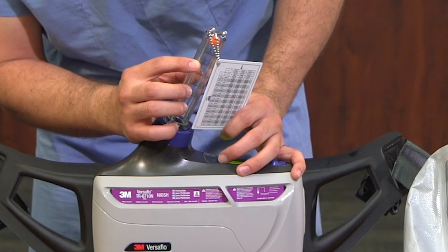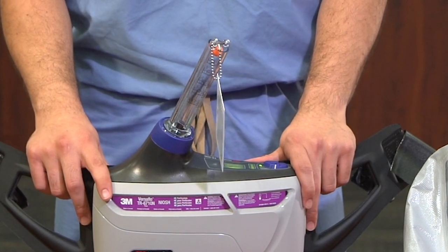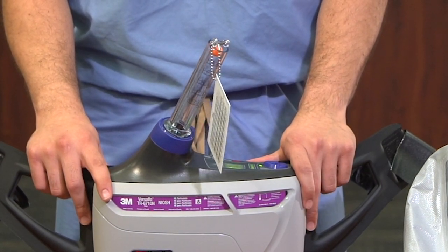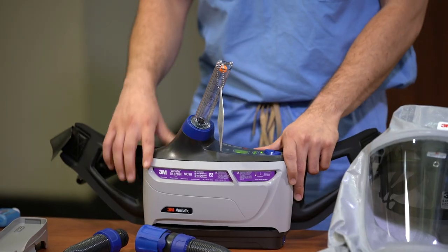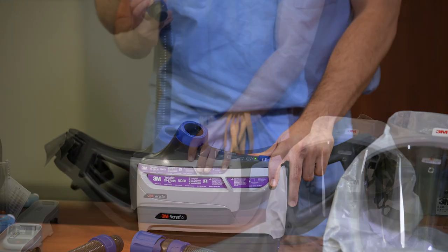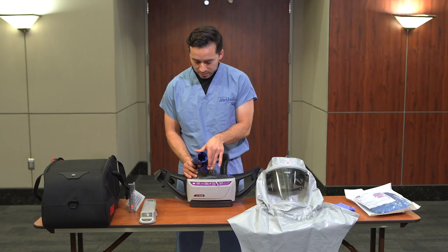If the orange ball does not float at or above the F mark, a different PAPR must be used as the device is not achieving proper airflow. Remove the airflow meter from the port and retrieve the air hose from the bag. Attach the hose to the airflow port and then attach the airflow meter to the hose.